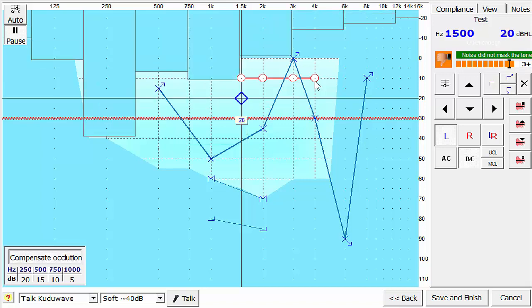So it's important to understand that the lateralization of bone masking doesn't depend on where you put the bone conductor, on the mastoid, left or right. Lateralization you do through masking. So if I want to test thresholds in the left ear, I mask the right ear. So the right ear cannot hear the bone conductor. Only the left ear will hear the bone conductor.